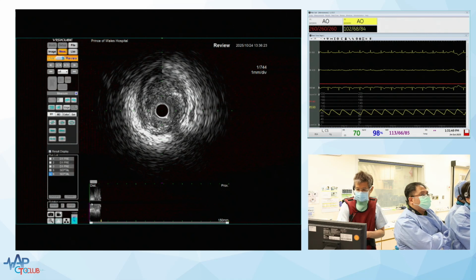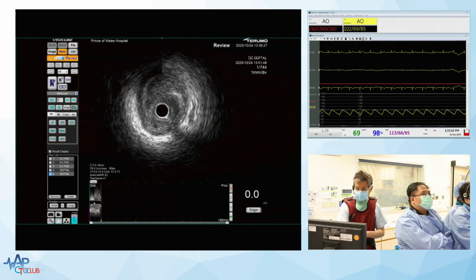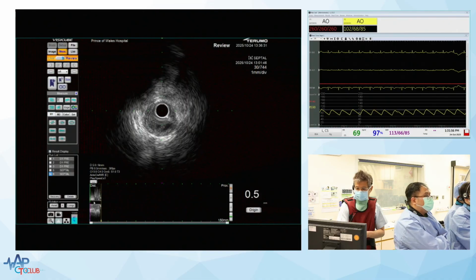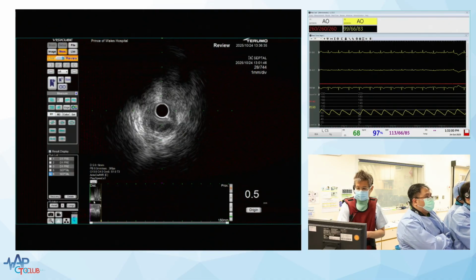I'll show you another one. This is the other one. You can see this cap. See? From the 12 o'clock, 2 o'clock, right? Yeah. 12 o'clock. Now is there one there, 12 o'clock? Can you put dynamic review on there?